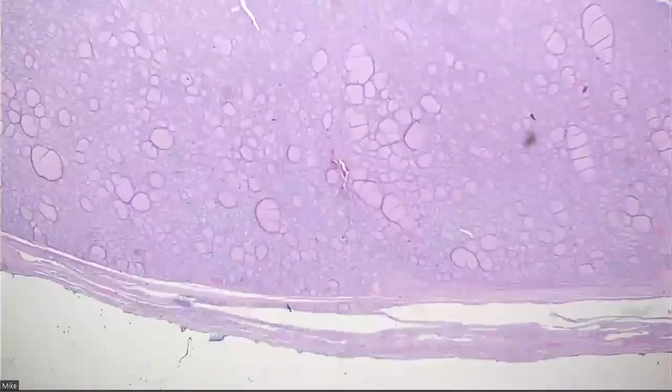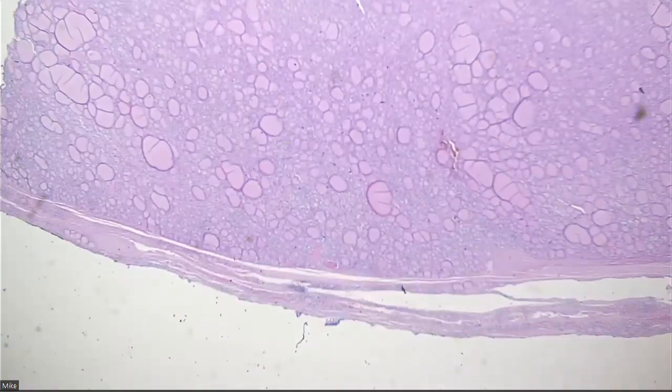Right, so for poorly diff, you need solid growth in the Turin criteria. Oh, this is it. All right, so here's a tumor that's got follicles over here, and then more of this kind of solid stuff over here.